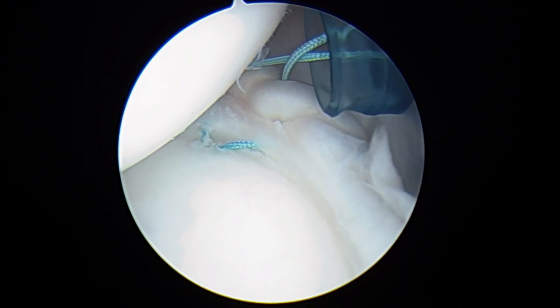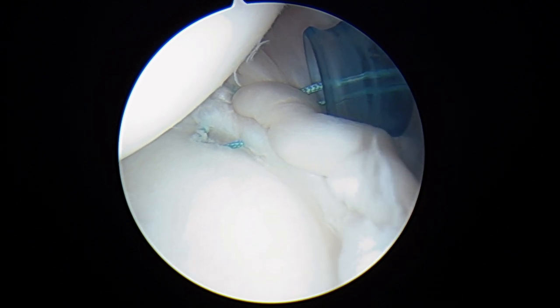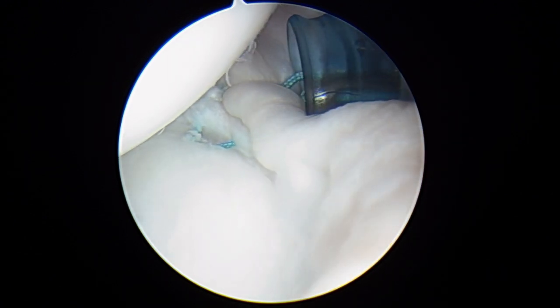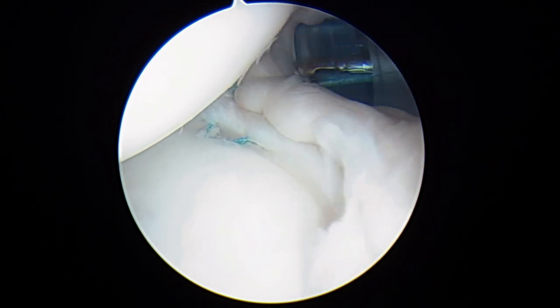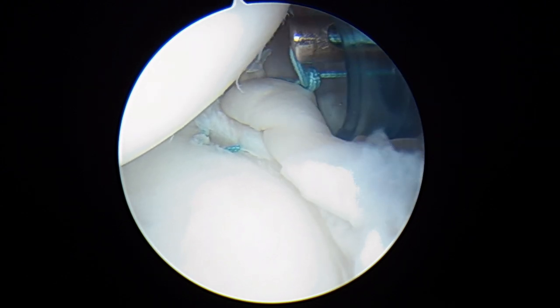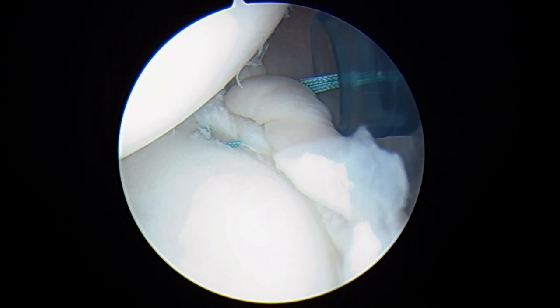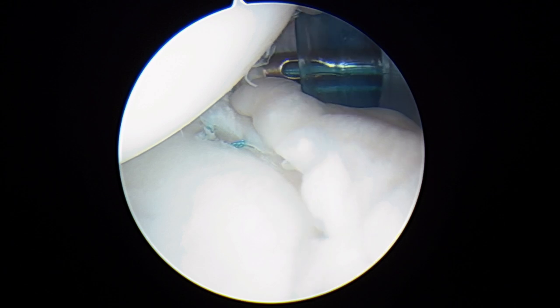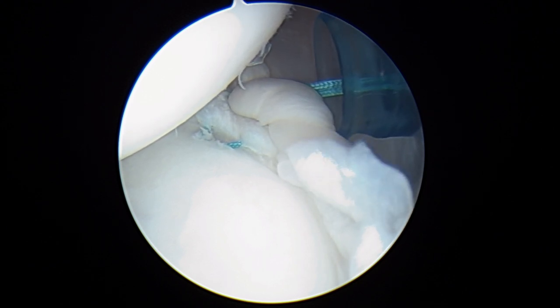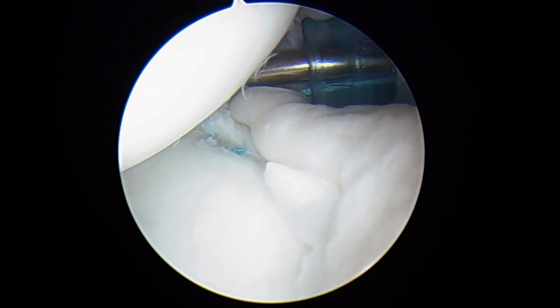Now we're going to do a Revo knot, which is a non-sliding knot. Anytime we do these more complex suturing techniques, we don't want to use a sliding knot. This is a lot like tying your tennis shoes through a straw — making these throws outside the shoulder and then passing them down using a knot pusher to secure this. Once you do about five of these half hitches, the knot is usually secure enough to snip the ends. We change posts as we do this by alternating tension on the suture strands. We'll do one more and then cut it — you can see how this creates another little fold in the capsule and in the labrum and tightens up that ligament. And we go ahead and cut the suture tails now.